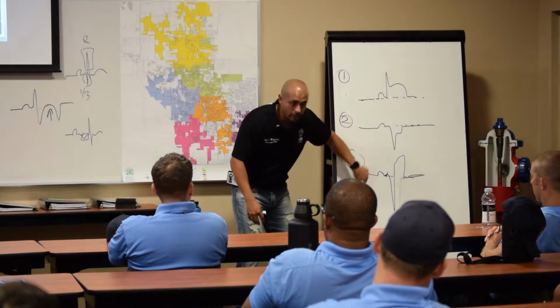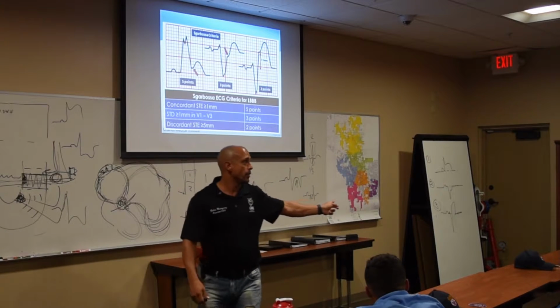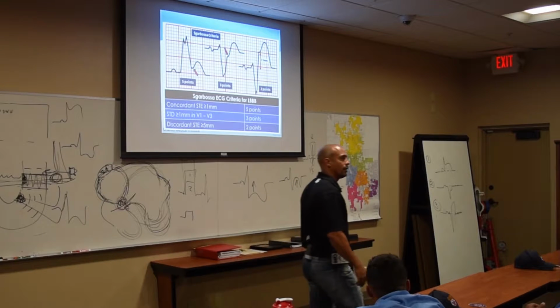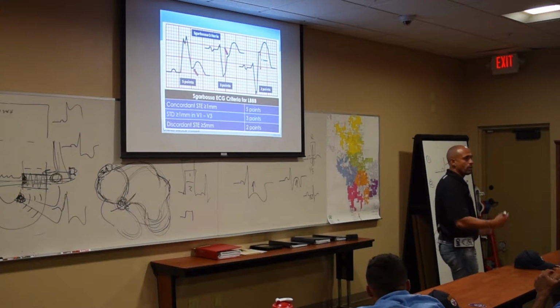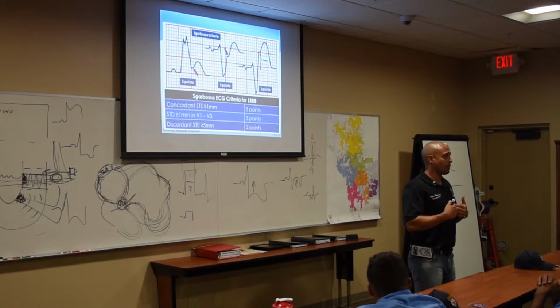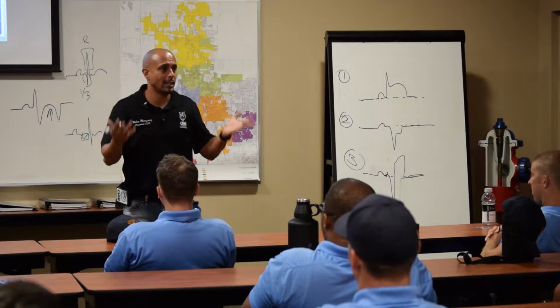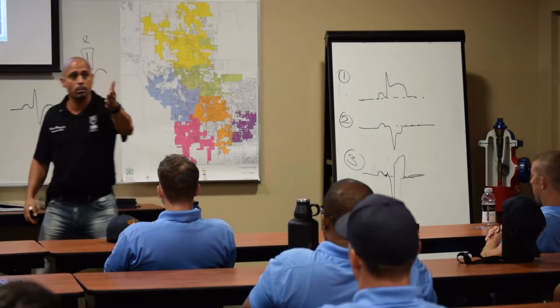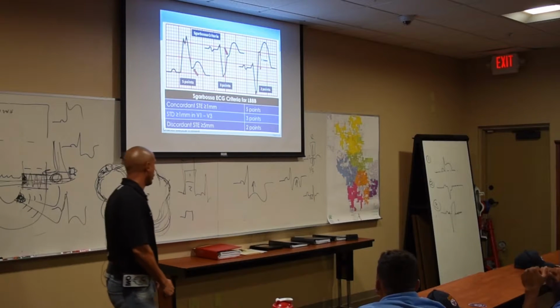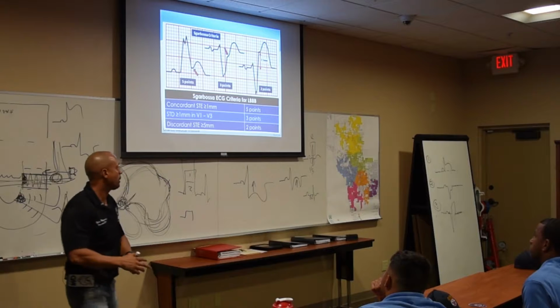If they meet any one of these three, you call it a STEMI. Is everybody with me? Does everybody understand that? Where your bundle branches sit, it sits in the septum. What leads look at the septum? V1 through V3. So if I have this in V1 through V3, I call that a STEMI if I have any one of these three. That's what I'm looking at. I'm looking at V1 or V3 to see if I have concordant or discordant, whether it's above the isoelectric line, below, or on the opposite. Is everybody with me?